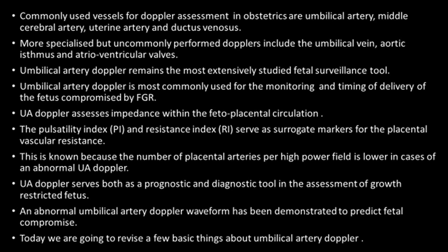umbilical artery Doppler. Umbilical artery Doppler serves both as a prognostic and diagnostic tool in the assessment of growth restricted fetus. An abnormal umbilical artery Doppler waveform has been demonstrated to predict fetal compromise. So, today we are going to revise a few basic things about umbilical artery Doppler.